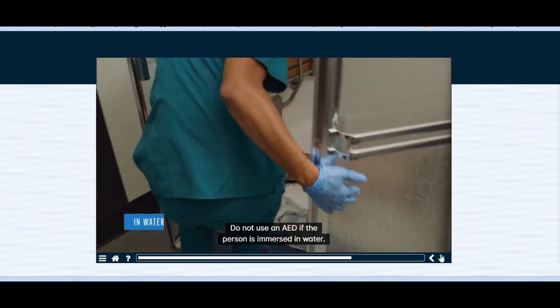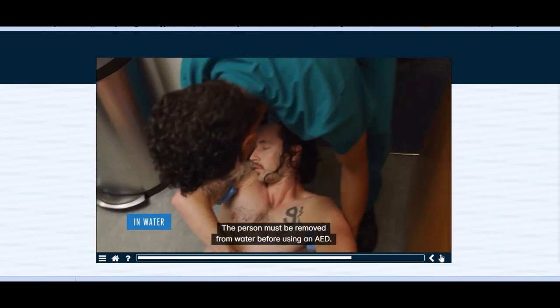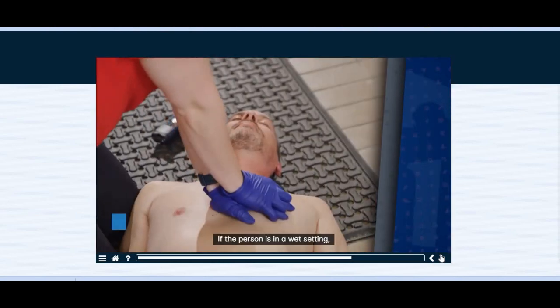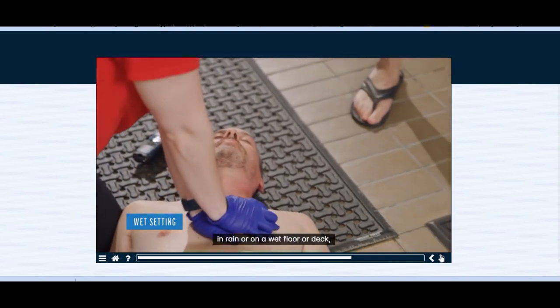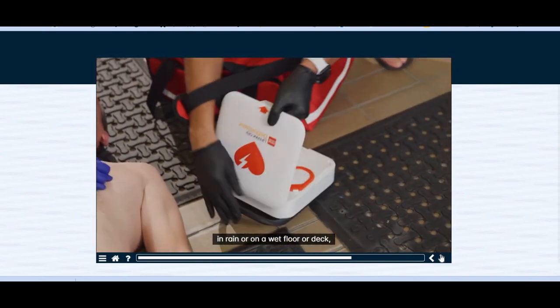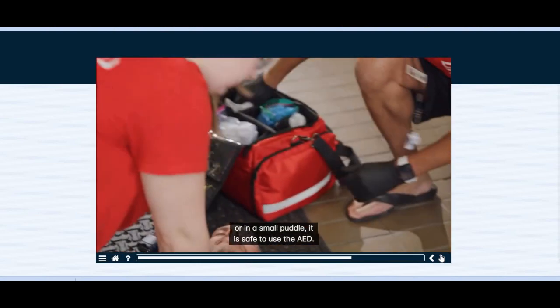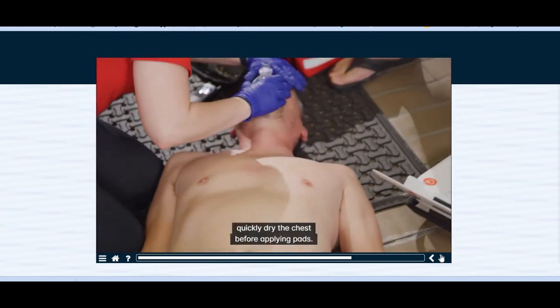Do not use an AED if the person is immersed in water. The person must be removed from water before using an AED. If the person is in a wet setting, such as lying in snow or ice, in rain, or on a wet floor or deck, or in a small puddle, it is safe to use the AED. If the person's chest is wet, quickly dry the chest before applying pads.